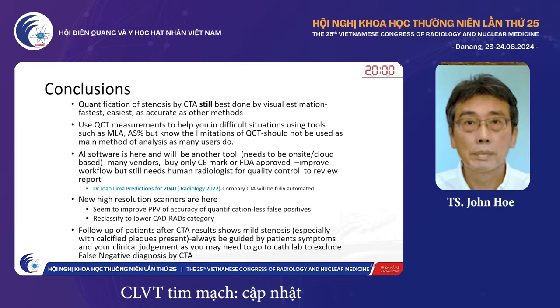AI software is here and will be another tool, needs to be on-site and cloud-based. Many vendors available, buy only CE mark or FDA approved, improves workflow but still needs human radiologists for quality control. The high-resolution scanners are here, seem to improve positive predictive value of accuracy of quantification, less false positive, and can reclassify patients to a lower CAD-RADS category.